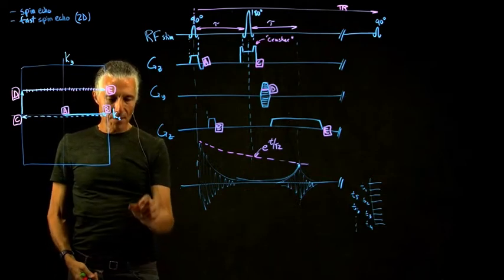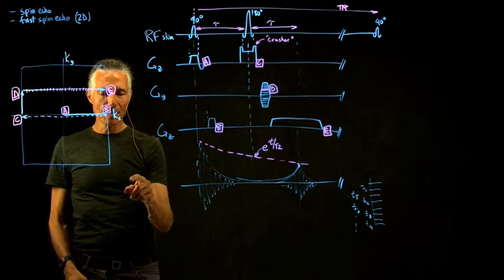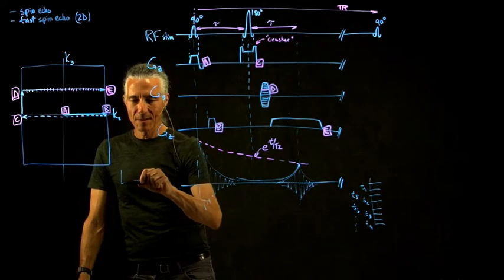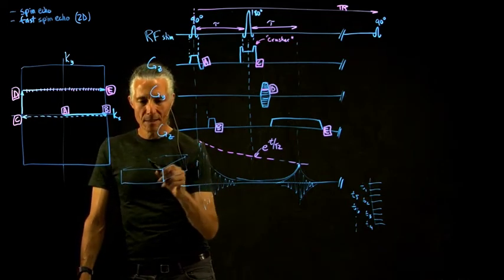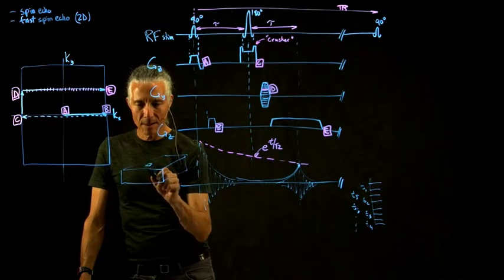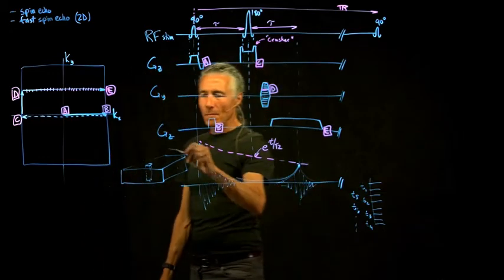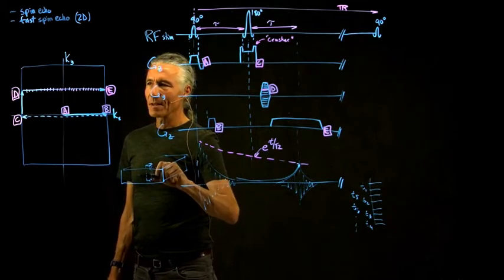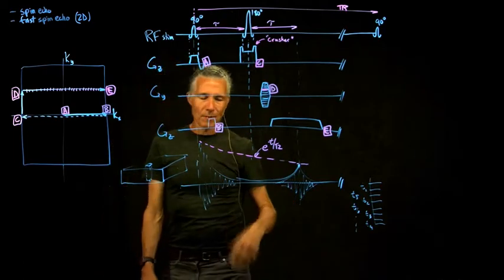So you could get maybe a 6 millimeter slice, which is pretty thick. It might have 1 millimeter in-plane resolution, but the slice is kind of like a slab, so the voxels in this slab are like little things that go through like that. So there might be like 1 by 1 by 6 millimeters thick, and so they're going to blur in this axis quite a bit. Even that would take 40 minutes to get all the way through the brain.